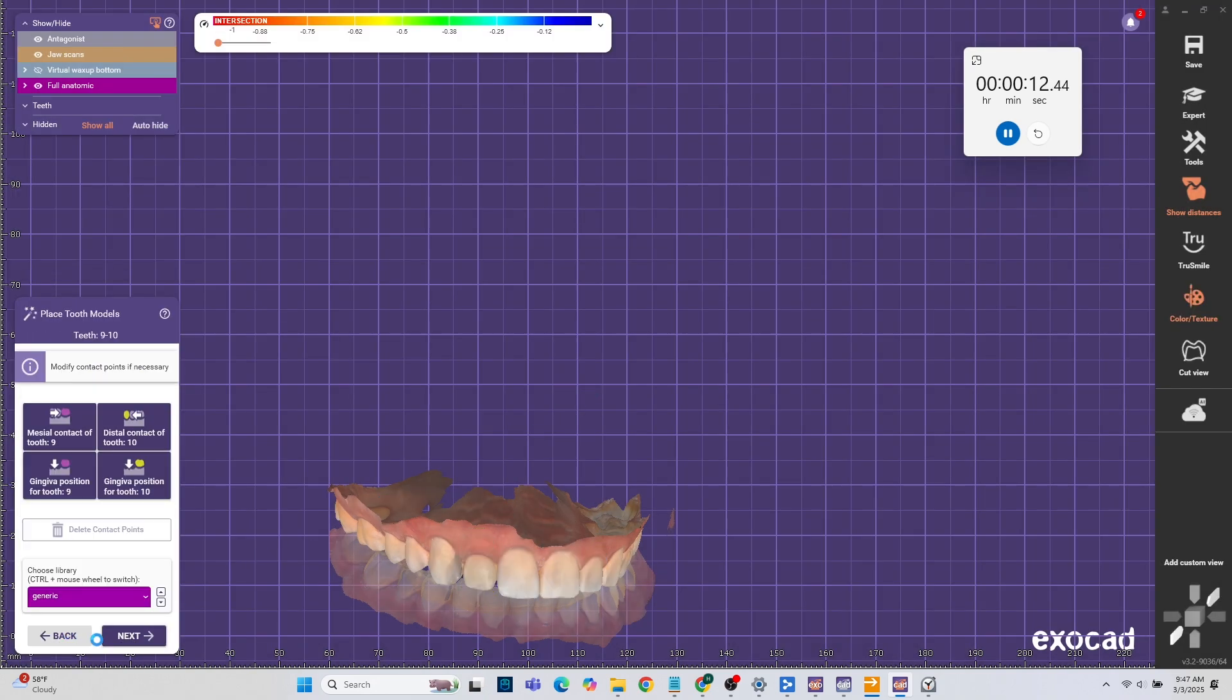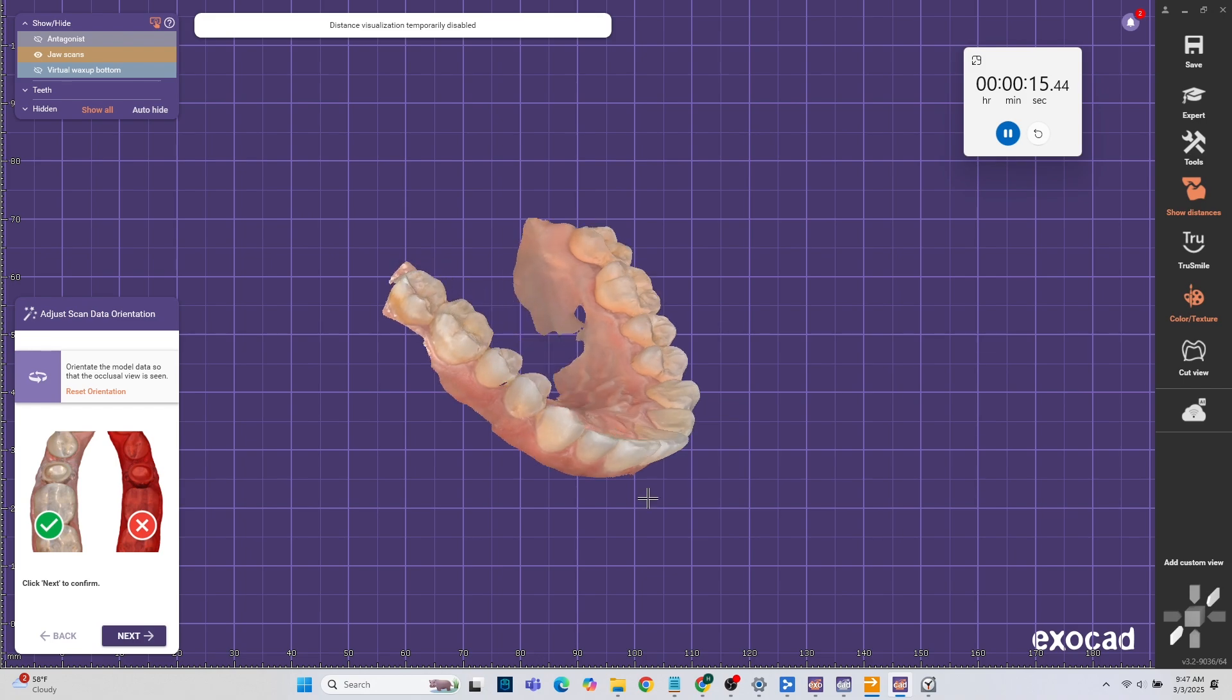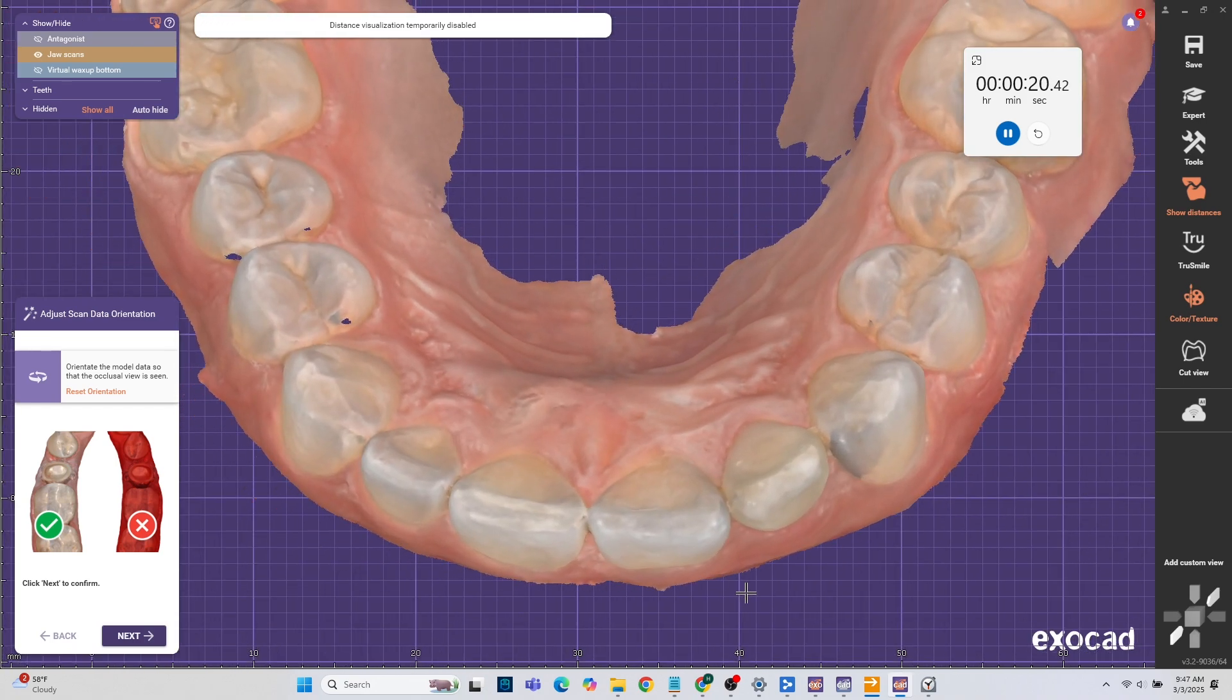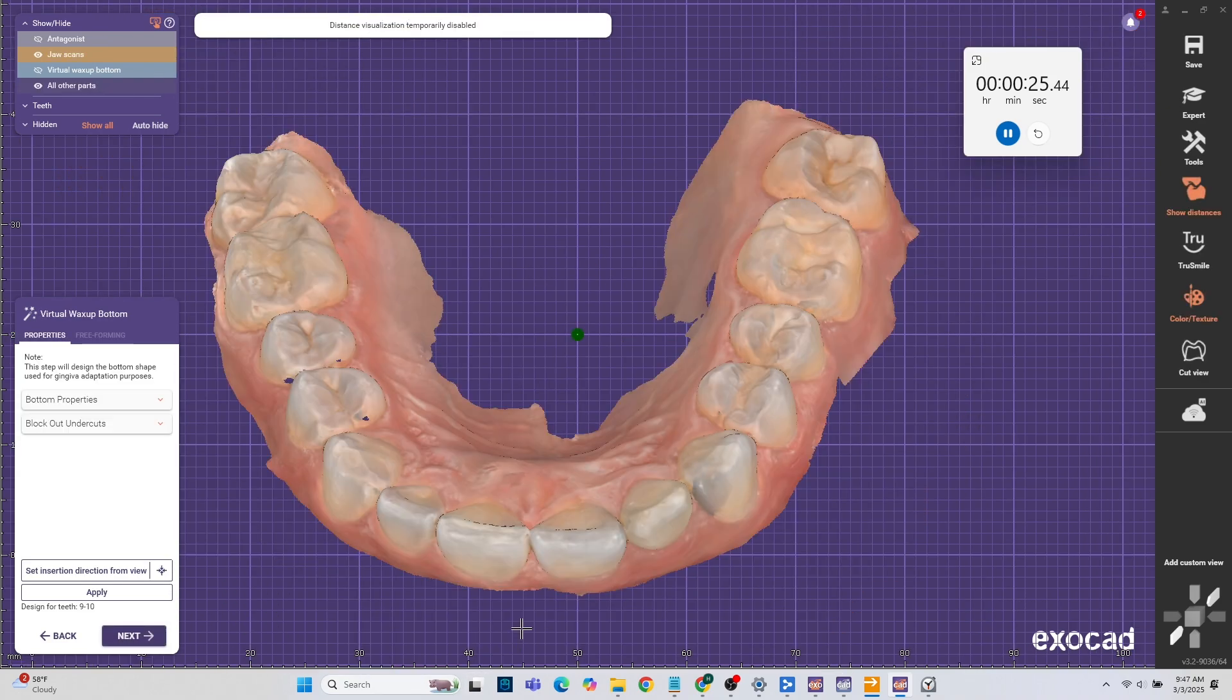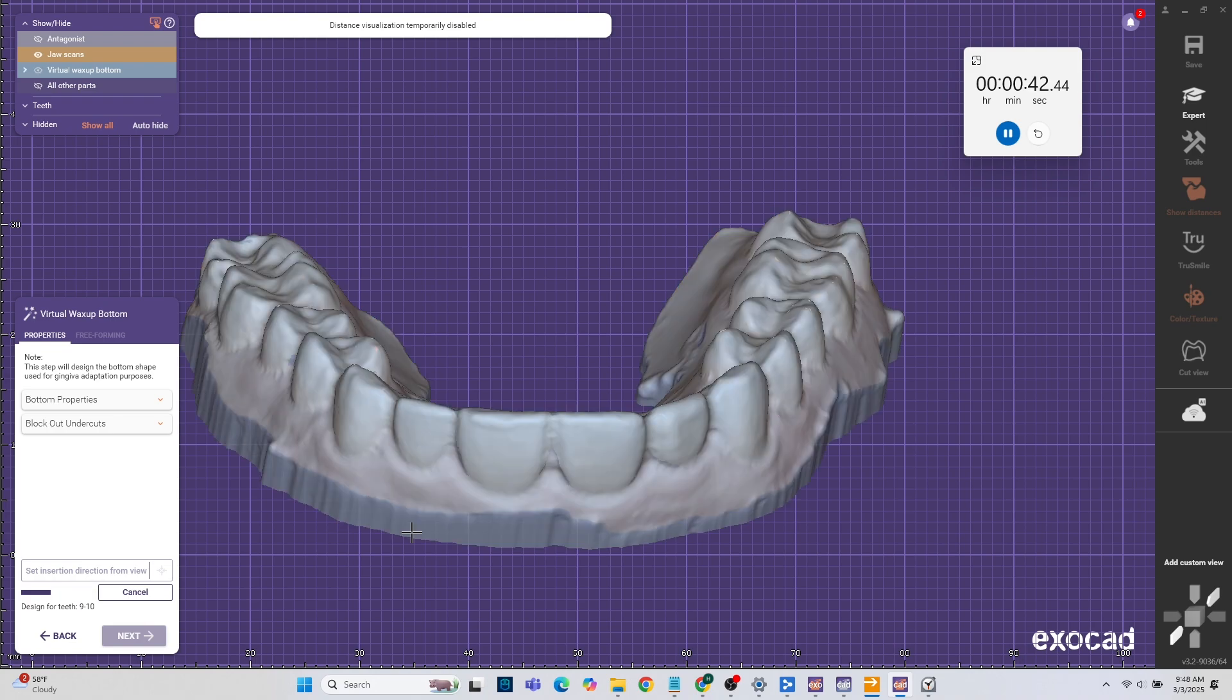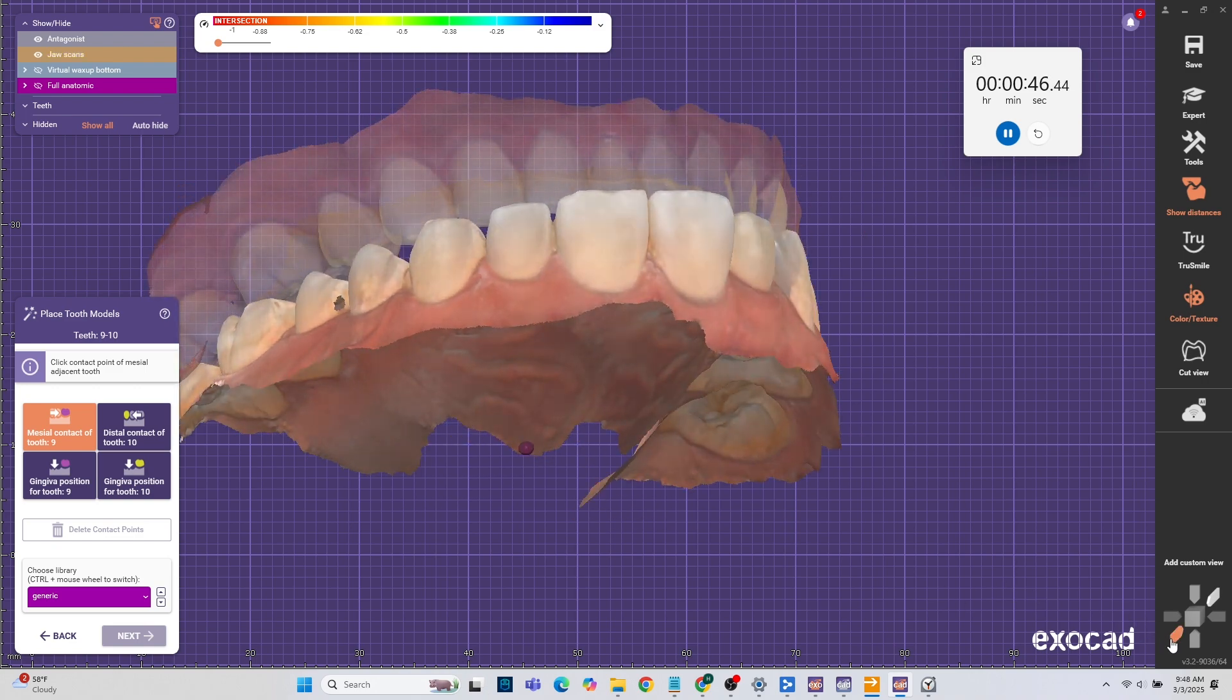Basically we just add two random teeth and we do the virtual wax up bottom. We're going to align it where we want to see a little bit of the cervical on both sides so it has a nice and easy insertion. Once you get that down just hit next, let it calculate. You can see the little marks on the sides. Those are the undercuts that will be blocked out.